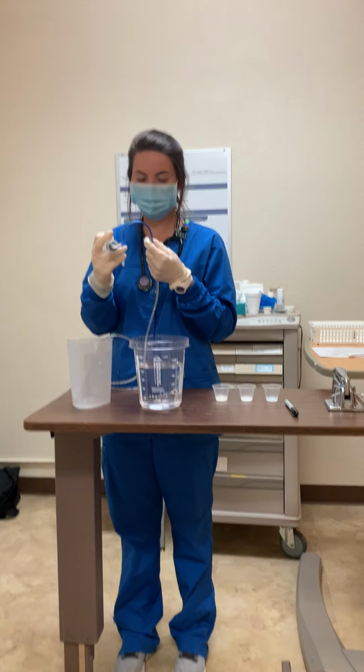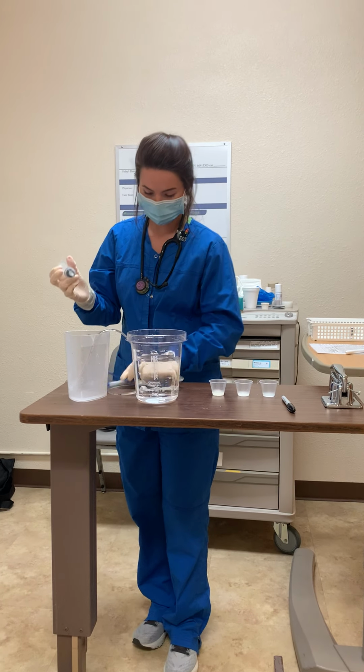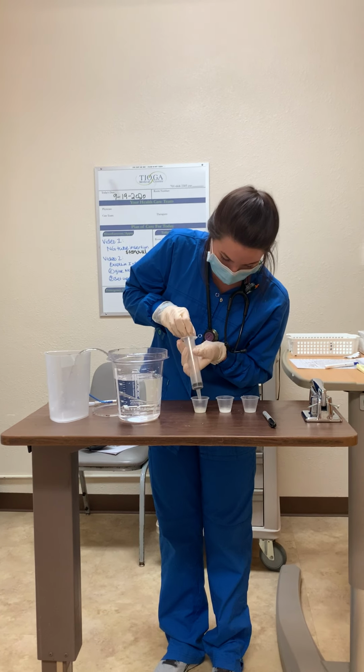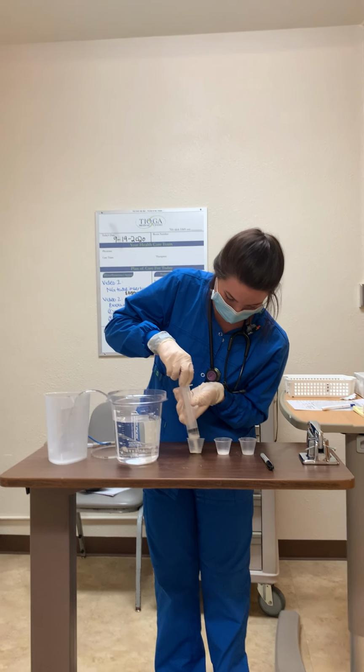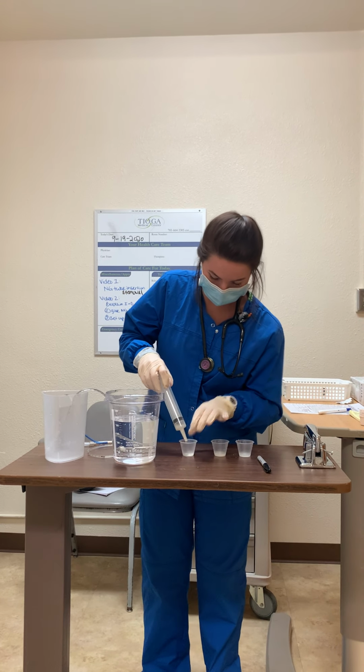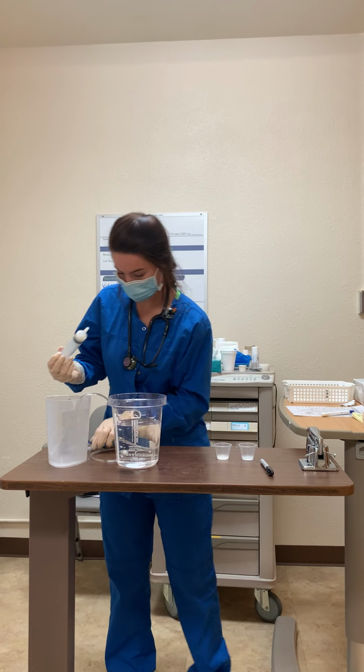Okay, so now that that's been flushed, we're gonna do one medication at a time. So we'll do this one first. Okay, make sure we have all of our liquid. We'll go to the garbage.